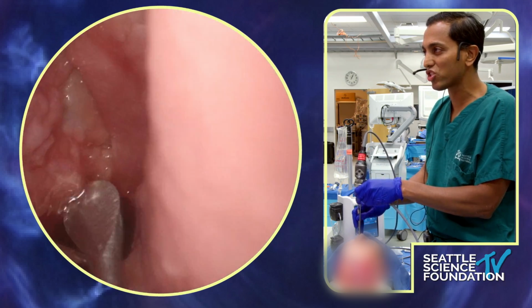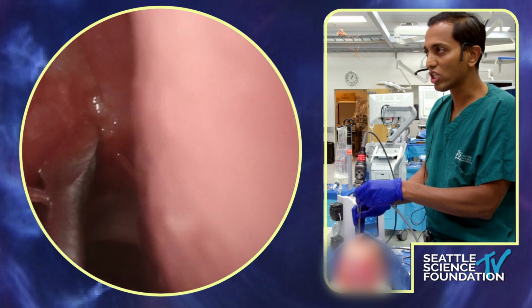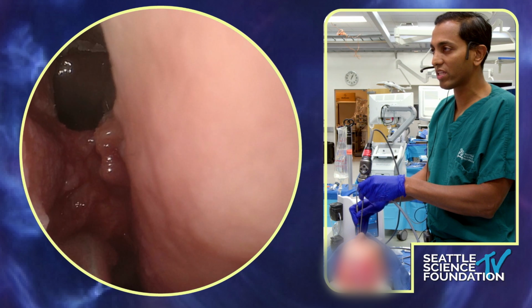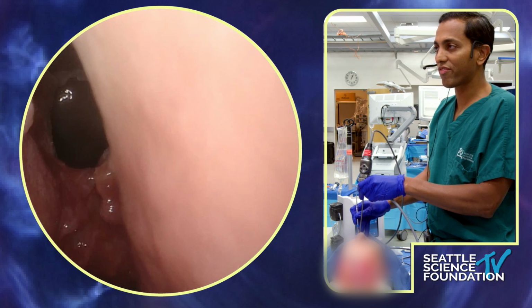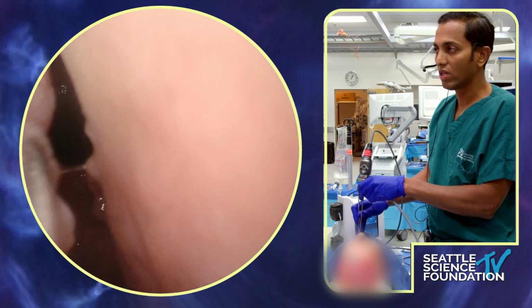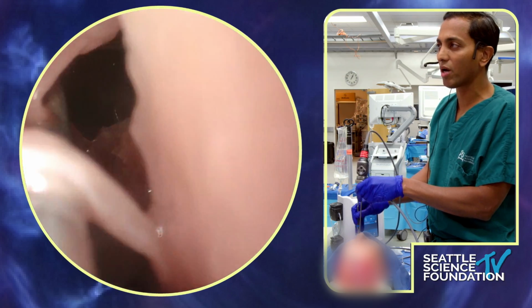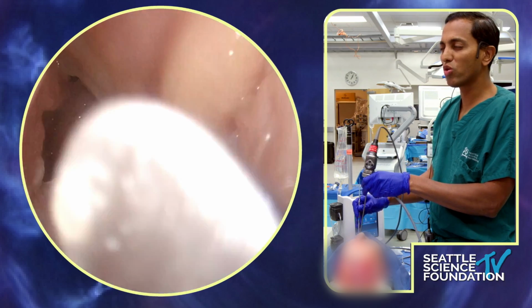You can do whatever size you want. I just did a small one just for the sake of time here. But essentially you can elevate this little graft like this. And this is a flap, sorry. Very nice. You can elevate up, and you could lay that over. This one's going to be a little small lengthwise, so you do want to take it further up.